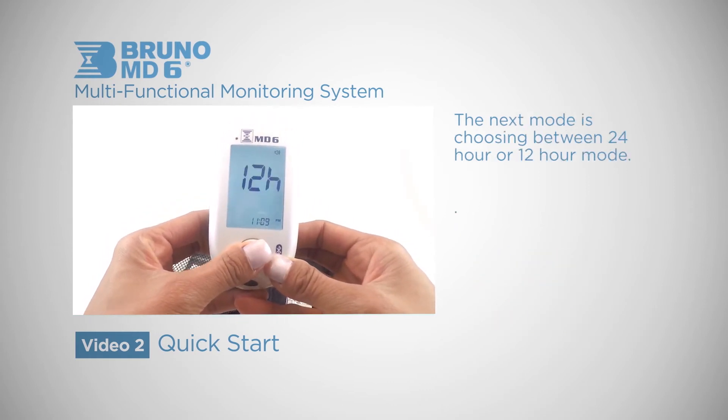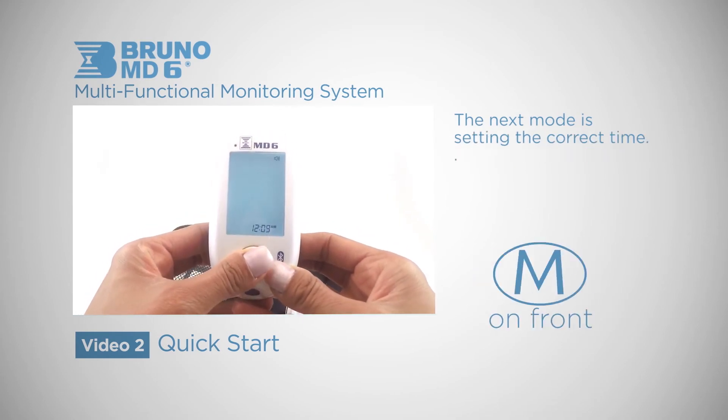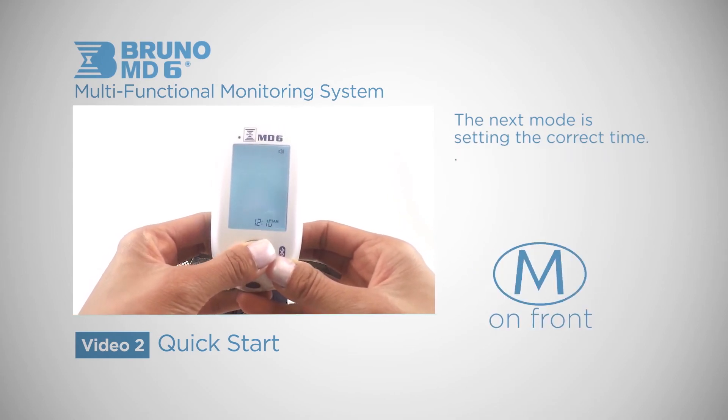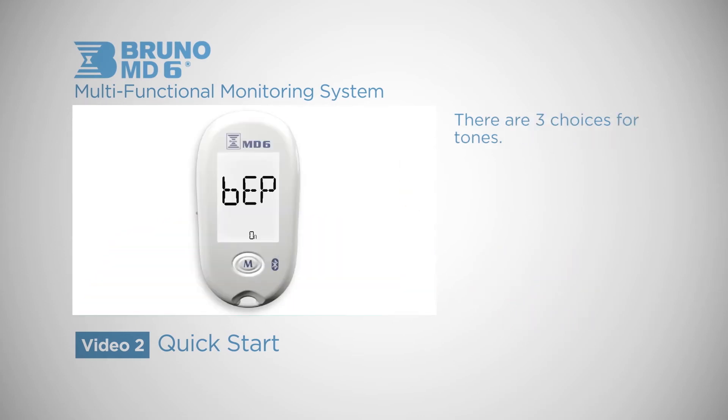The next mode is choosing between 24-hour or 12-hour mode. Remember to choose between AM or PM if you are in the 12-hour mode. Then you can select Beep On, Universal Tone, or Beep Off.